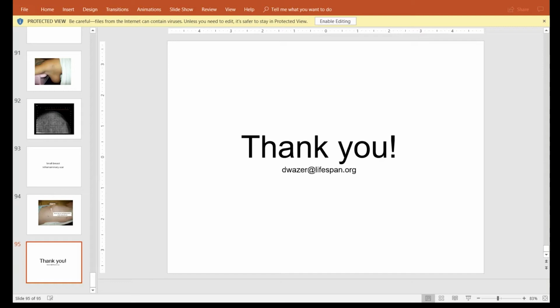Dr. Dev? Yes, I have a question. I just want to know what is the maximum tumor size that we can accommodate with this AccuBoost? The maximum tumor size? Well, it's really driven by the maximum applicator size, and the largest applicator size is 8 centimeters. Okay. Ray, I'm going to ask you to answer that one. It is 8 centimeters, is my understanding. Yeah, we have two shapes of applicators. A standard round applicator, the largest is 8 centimeters ID.